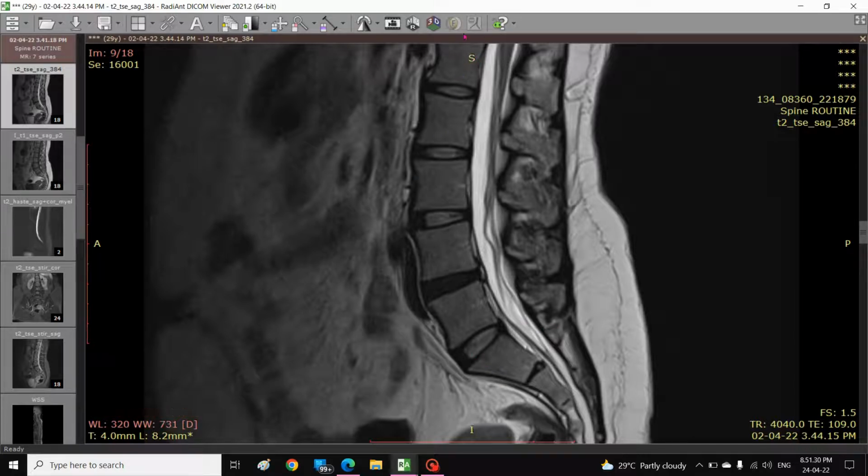a healthy curve here, and the lumbar lordosis is preserved, and there is no major vertebral end plate fractures, or the bone shape is retained, and there are no Modic changes. So in those aspects, the spine is healthy, except for this one degenerated disc, which is kind of a bulging disc. So let's correlate this sagittal view along with the transverse view in the next image.